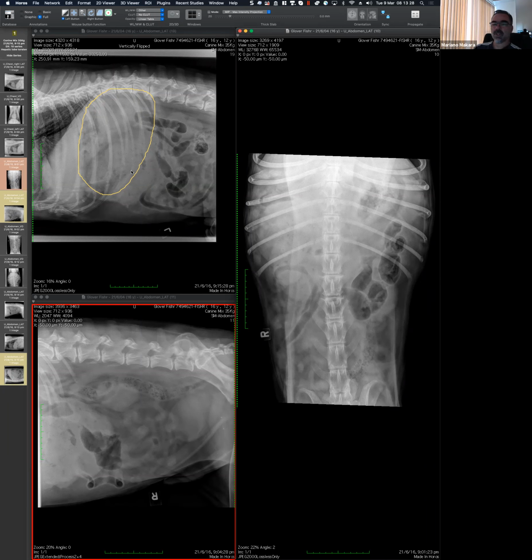Jennifer, was that convincing? I agree completely, which is one of the reasons I was a bit borderline about whether that outline really was the stomach or whether I was seeing things. You don't need to be defensive. This is the way it works. Someone brings something and then we keep going. There were two interesting points.